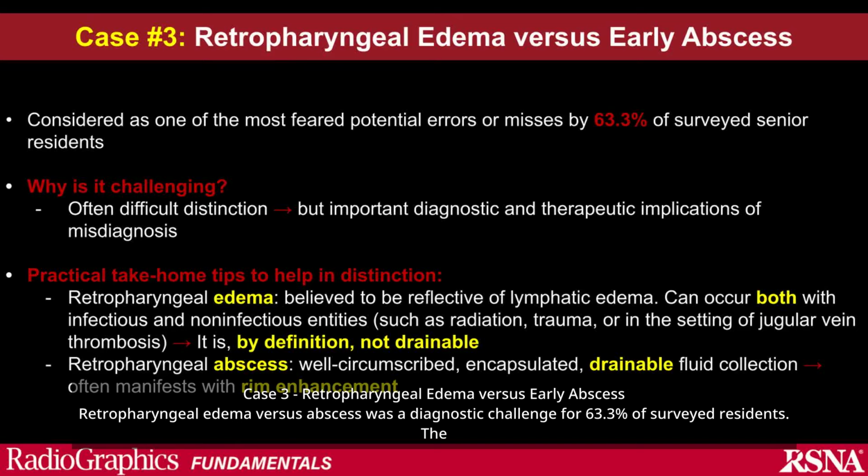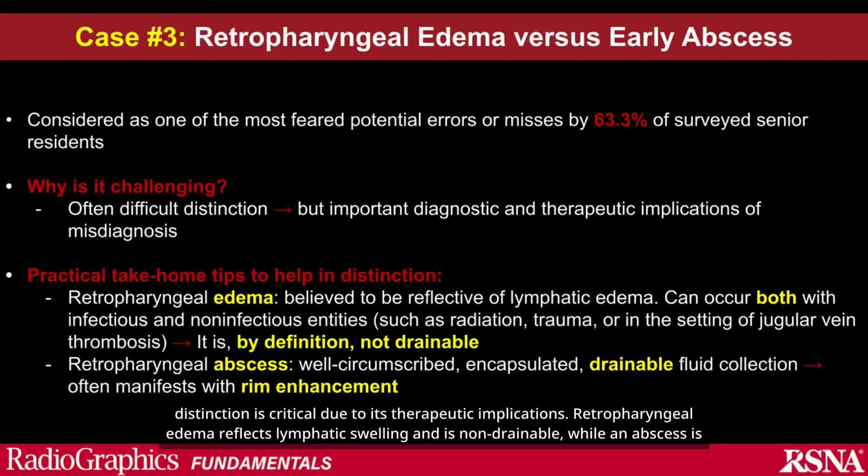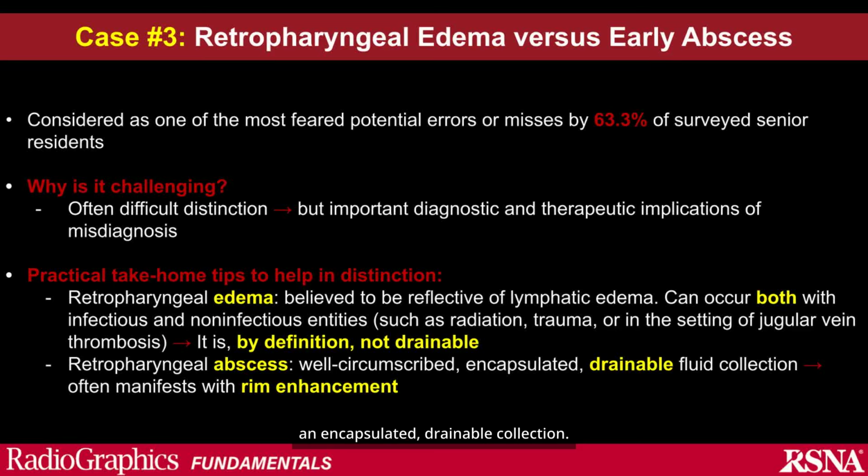Retropharyngeal edema versus abscess was a diagnostic challenge for 63.3% of surveyed residents. The distinction is critical due to its therapeutic implications. Retropharyngeal edema reflects lymphatic swelling and is non-drainable, while an abscess is an encapsulated, drainable collection.